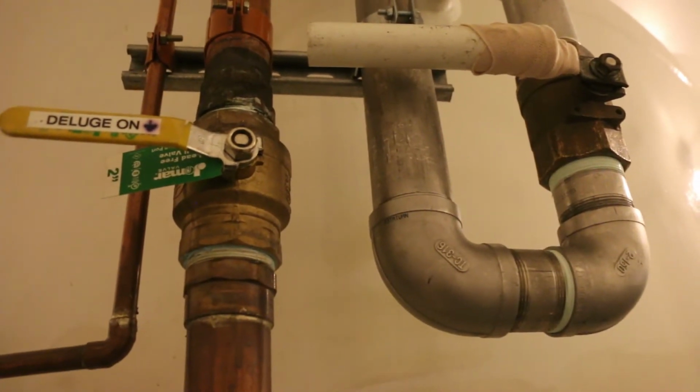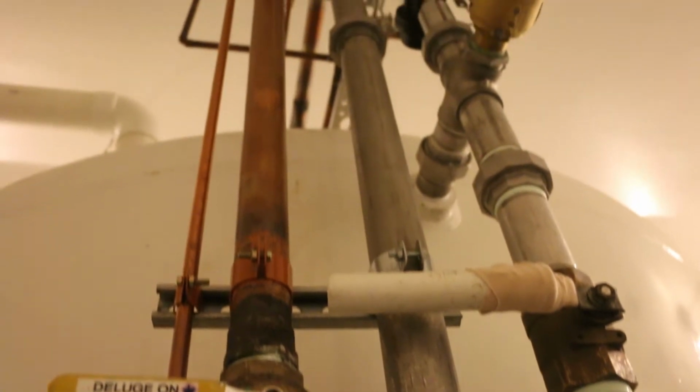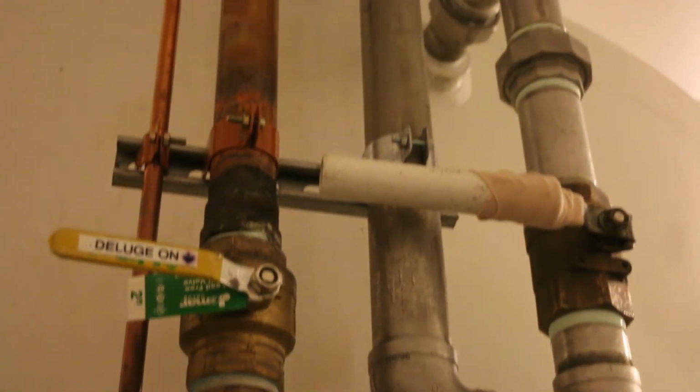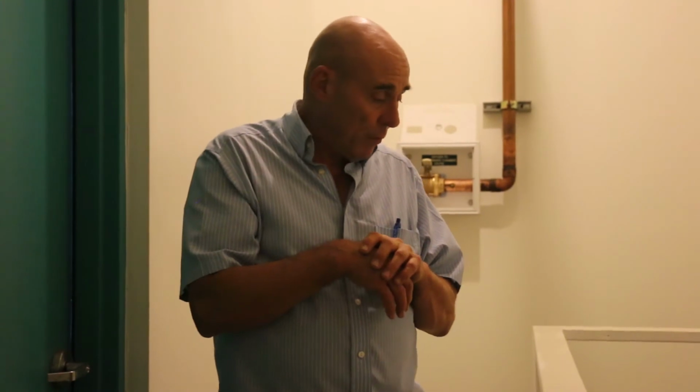There's a single lever that's pulled, and it's right next to the vent, so in the event of a problem, we vent the chamber and deluge at the same time. The 2 levers are there together, so that's like the red handle button if there's a problem. And again, that's not expected to be needed, but we're prepared if we have to do it.